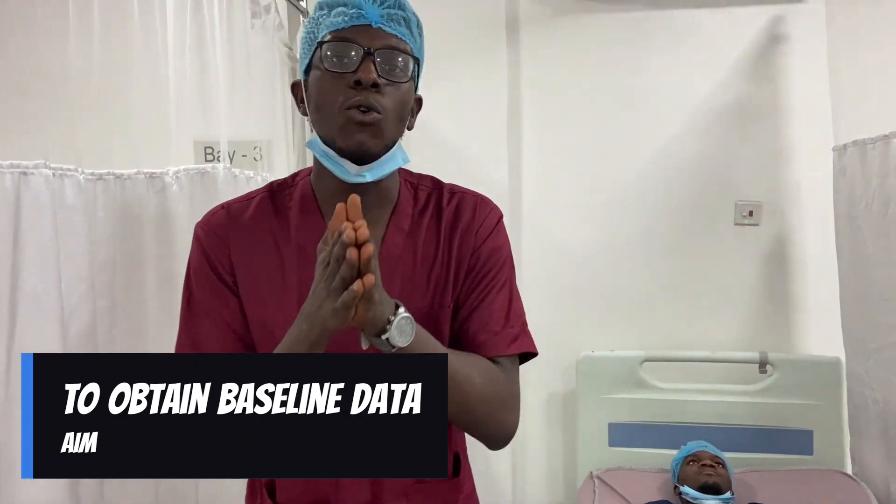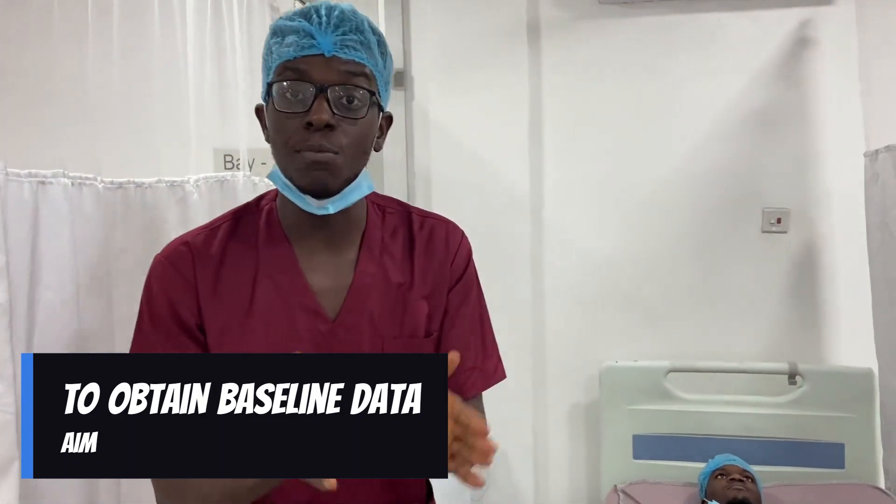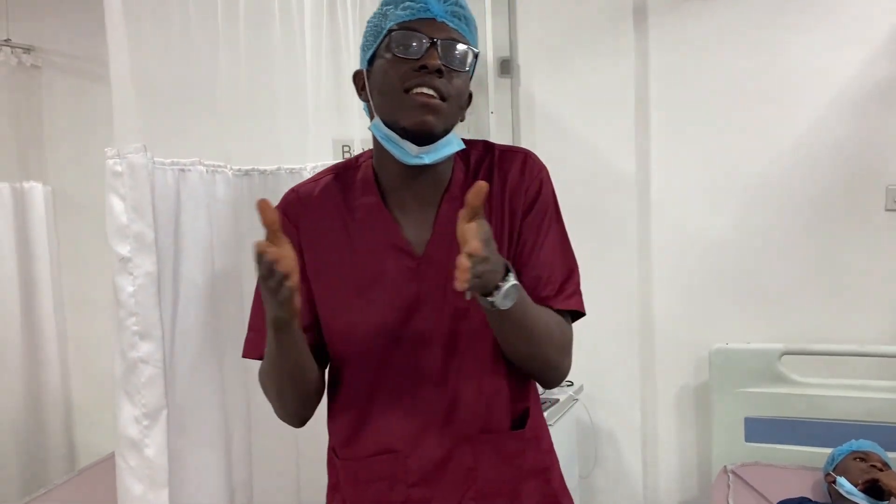We're going to be doing vital signs. Vital signs are the normal nursing procedure that is very essential. The aim of this vital signs procedure is for you to get the baseline data of your patient. Baseline data has to do with your patient's pulse, blood pressure, and temperature — things that give you an idea of what the patient's body is like before you carry out any extra procedures.